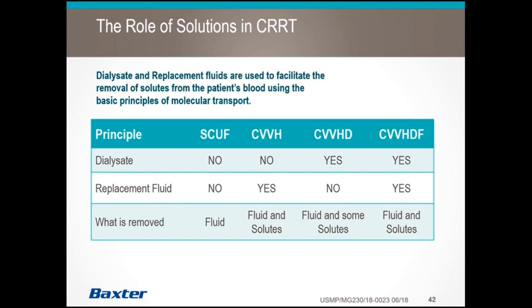And then with CVVHDF, you have dialysate and replacement solution working together, and you're going to be removing fluid and solutes of all molecular sizes that are within the filter's capacity to remove.